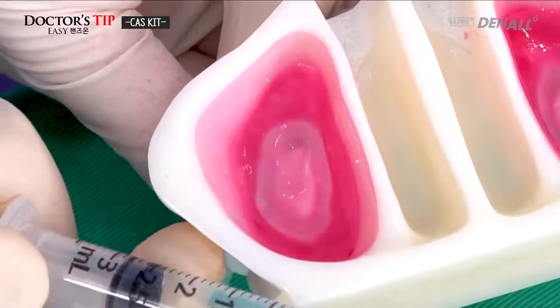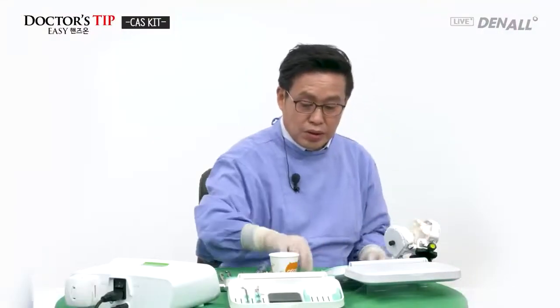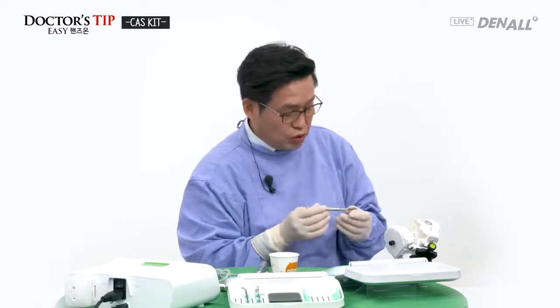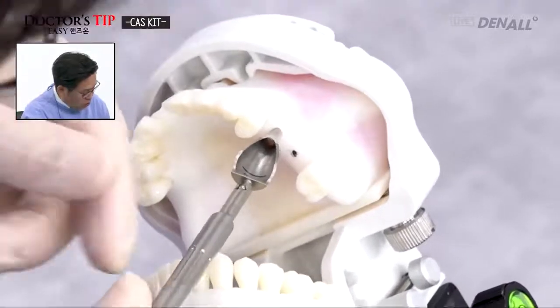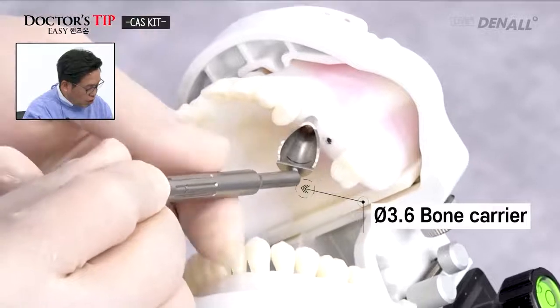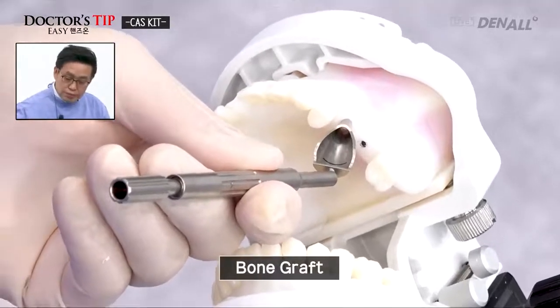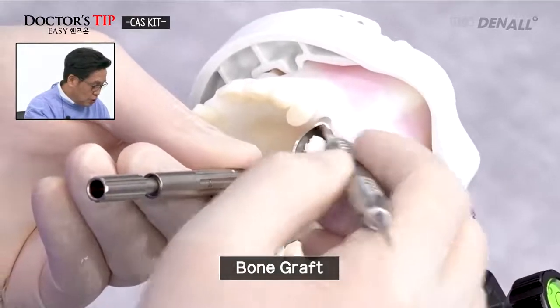The sinus membrane is being elevated. Hydraulic elevation is finished. Now it's time to do the bone grafting. The final drill was 3.6. This bone carrier is inserted into the hole, and from the back we can adjust the angle into the bone carrier. The graft material is inserted.